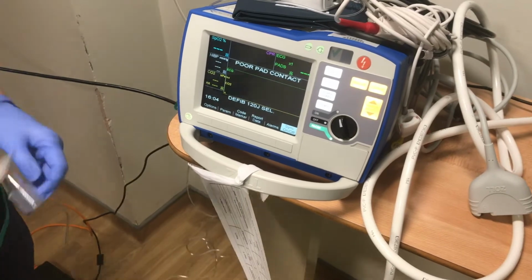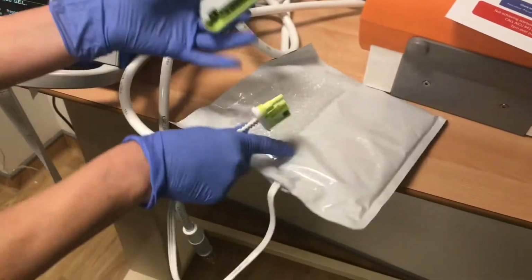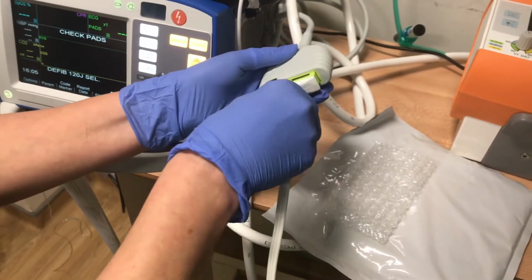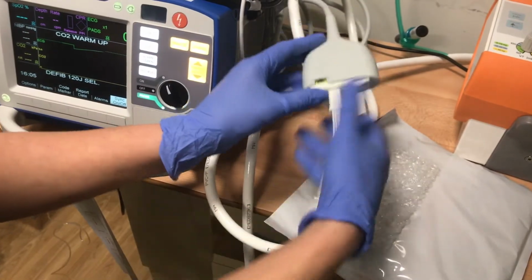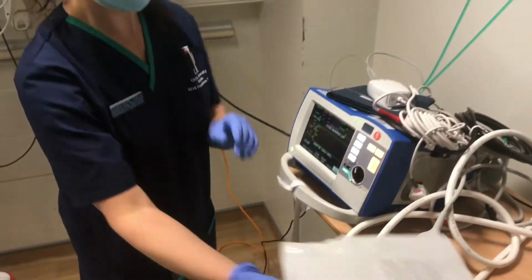The defib pads again are slightly different. They should be found attached, that way around, already pre-attached, where you would just literally open up the pads, attach them to the patient, and then you will be able to deliver a shock.